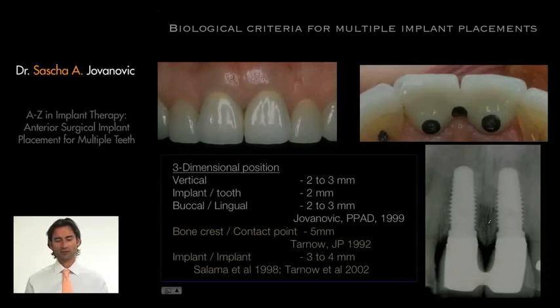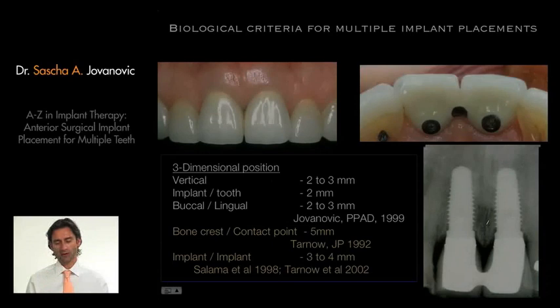And the distance between the two implants has been increased to about 3 to 4 millimeters. Therefore, as you can see, the bone level is high if you compare it to where the bone attaches to the implants. And in this way, we can actually increase the bone height. And if we can increase that by about, let's say, 2 millimeters, that gives us already a good aesthetic gingival papilla. At least one which the patient and the doctor can be happy with.